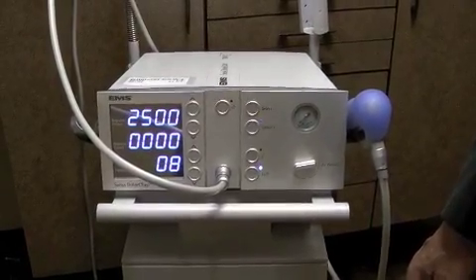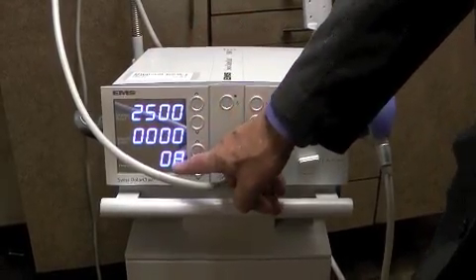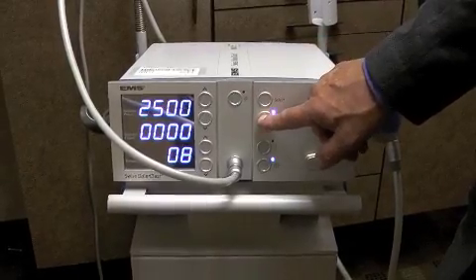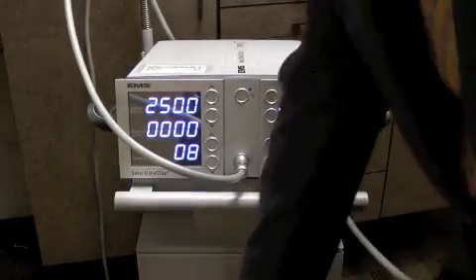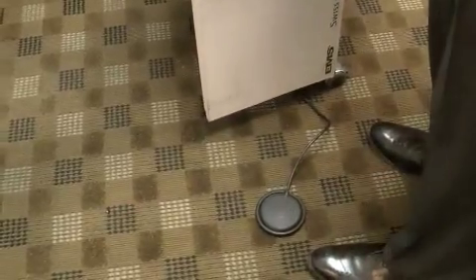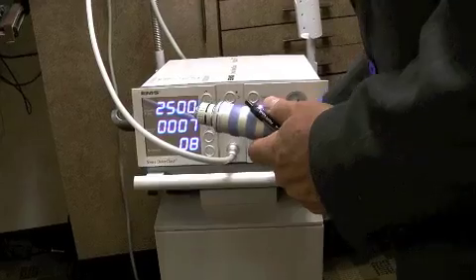When we have all our values set, we have 2,500 preset impulses, going to do it at a frequency of 8. We can press the validate button, which is the second button from the top, validate, and that locks everything for us. Okay, inside the unit, I think you have a pretty similar unit. You'll find the foot pedal that you can utilize. And depressing the foot pedal starts the machine working. So we'll have it on in that particular area.